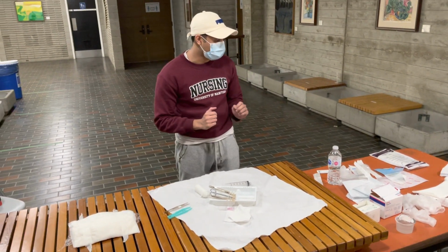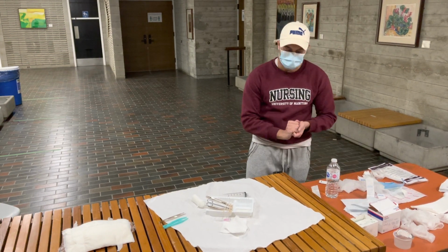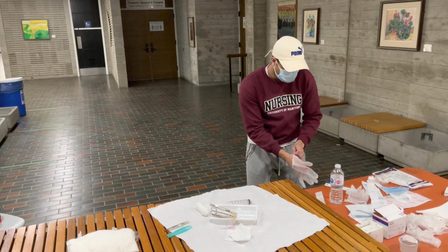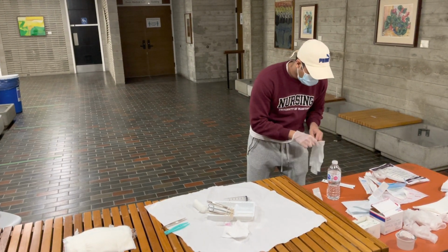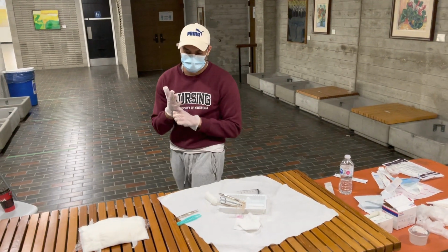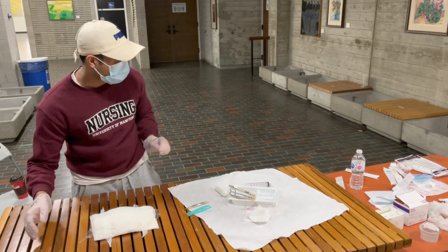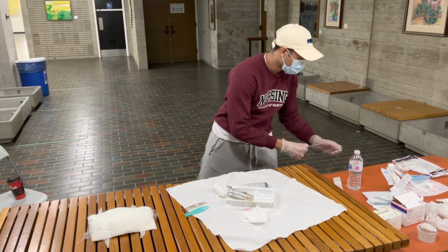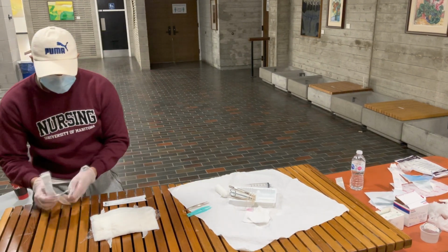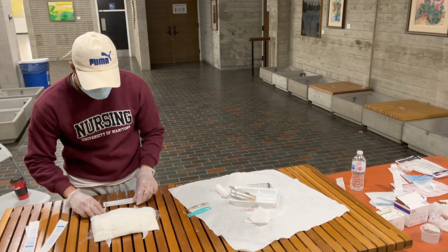So we're just going to now wash our hands and put our clean gloves on. So do that right now. Okay, and we're just going to go assess the wound here. So we're just going to get our ruler as well, and Q-tips, just to measure the wound. So Mr. Smith, we're just going to assess your wound now, okay?